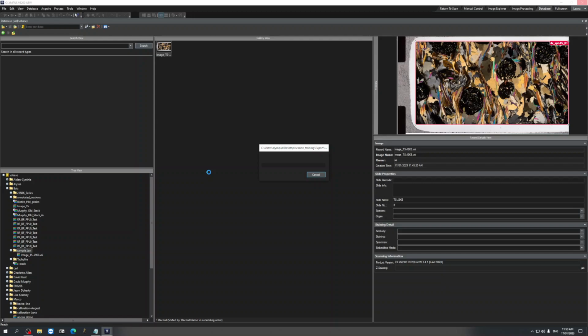Because we're working at 4x, it's not really bad. At 10x it would probably take you 5 minutes to download the image.